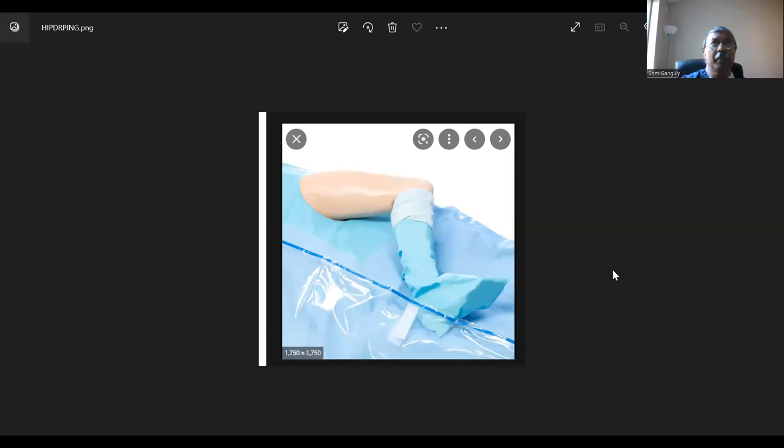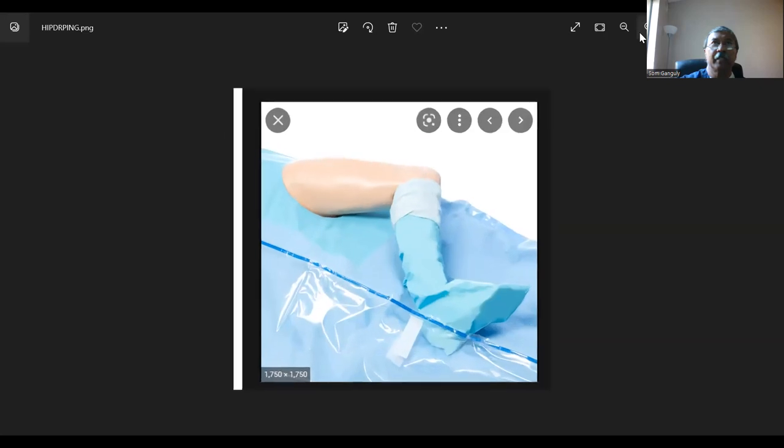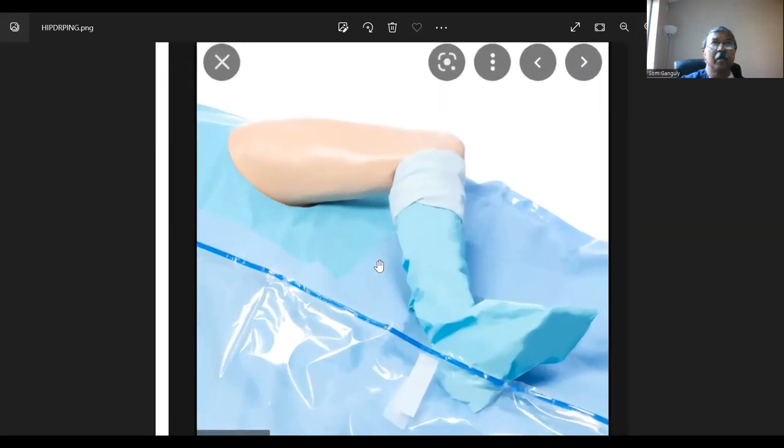This is how a hip can also be draped, called the free leg draping system. As you can see, the foot and all the way up to the knee is covered with a sterile impervious stockinette. Then an extremity drape, which has a hole in the middle, is placed over this leg and placed against the hip that needs to be operated. This extremity drape will cover the torso and the bottom of the foot of the bed.